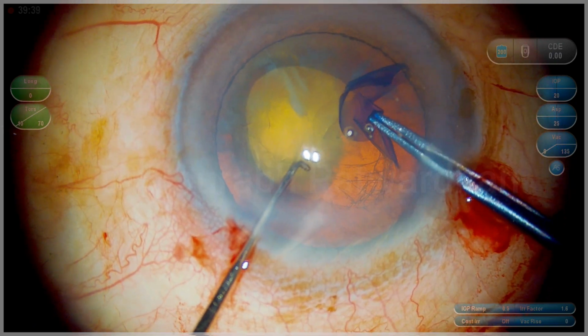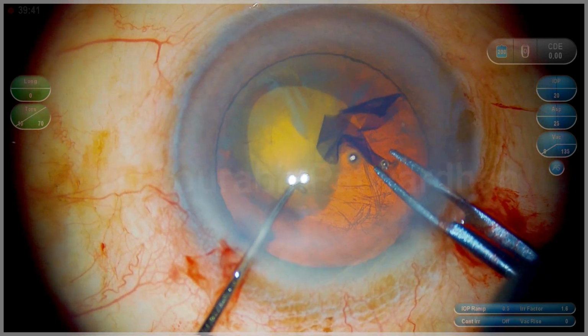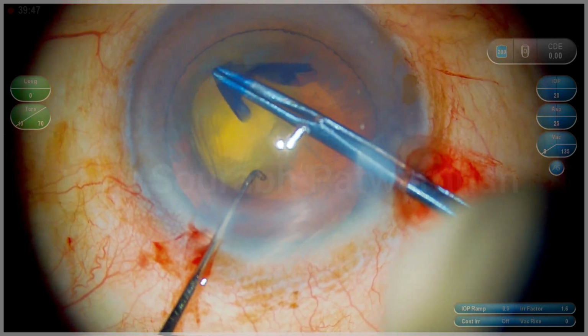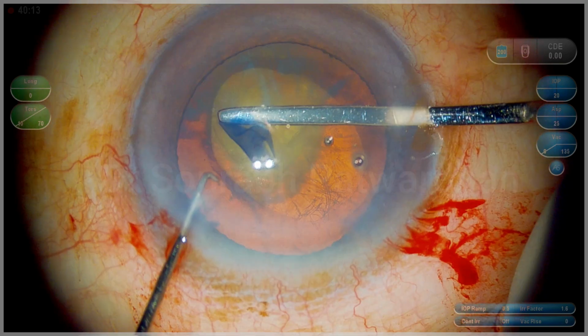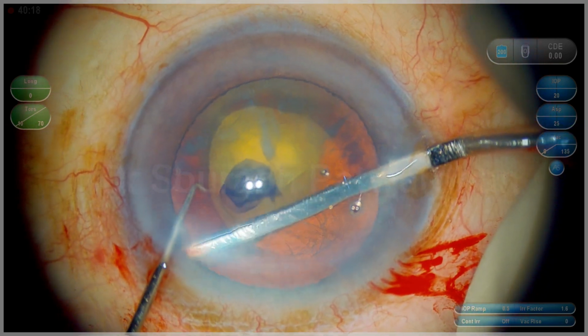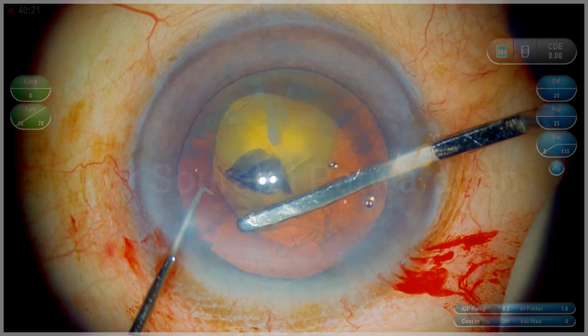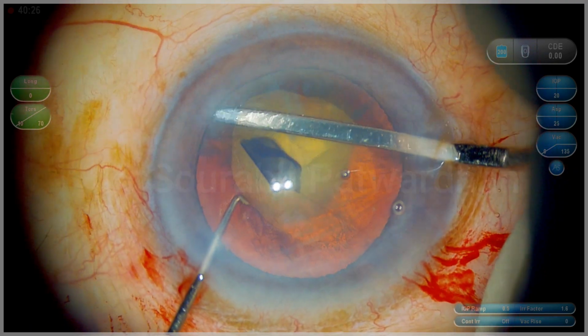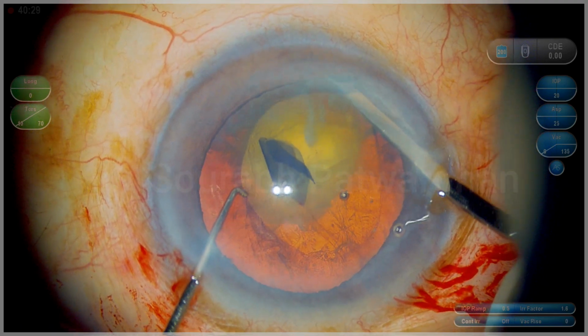But perpendicular to that, we have a smaller diameter which is around 4.5. So in case you have to do optic capture, you can do it quite easily. Also in the subincisional area, because on that side I generally keep the longer diameter of this oval rhexis, you can approach the epinucleus and release the epinucleus easily.